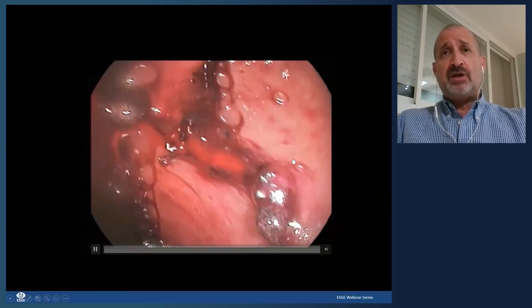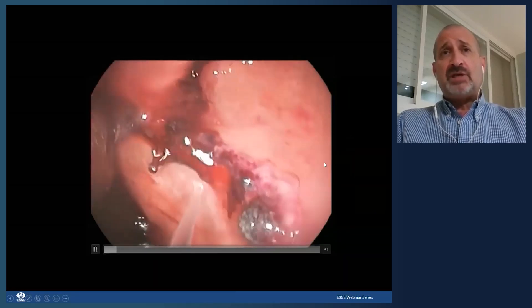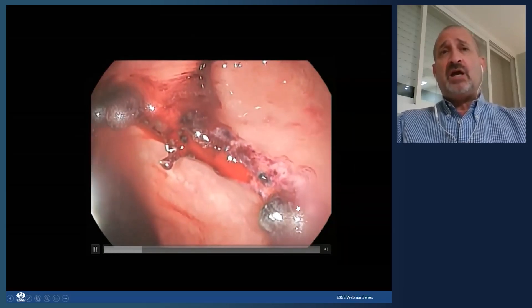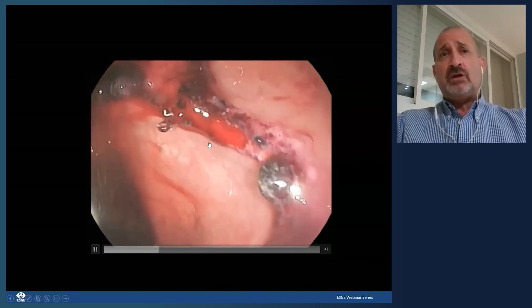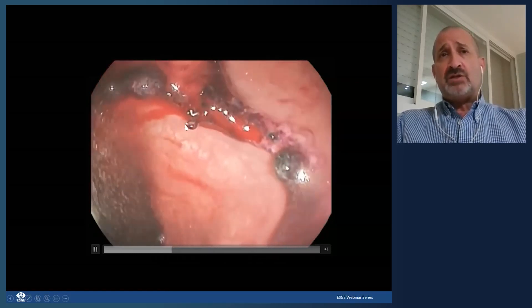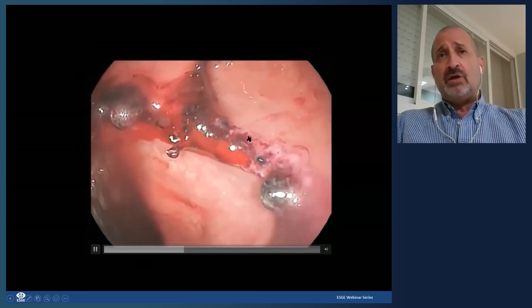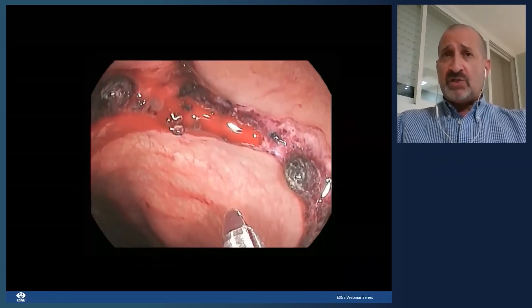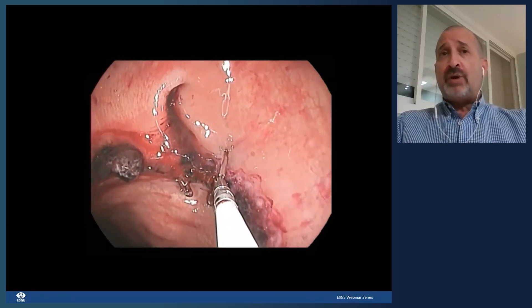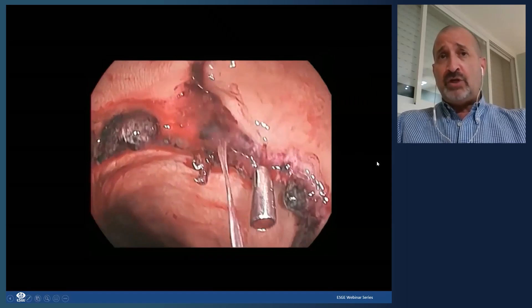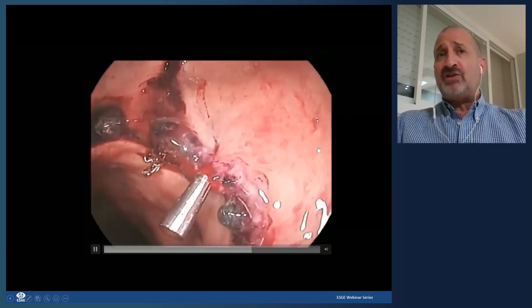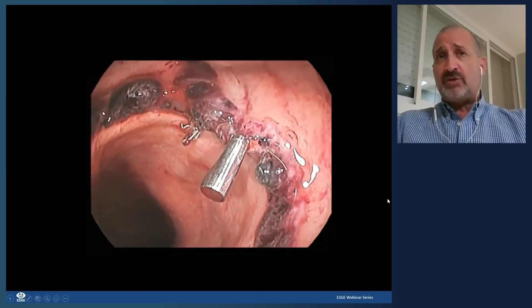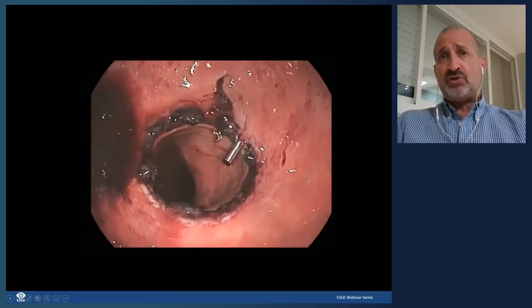Here is another example — an anastomotic ulceration with active oozing, likely from previous surgery. If there's just a little oozing and you can visualize the area, you may not need dilute epinephrine — you can go right ahead and place a through-the-scope clip directly on the site of bleeding. This causes mechanical compression and the bleeding stops — as you can see, it's no longer oozing.